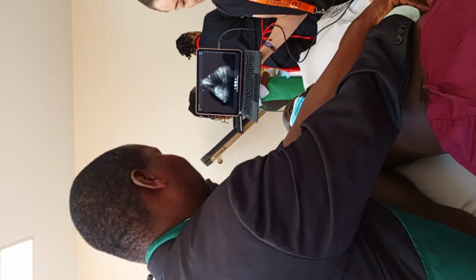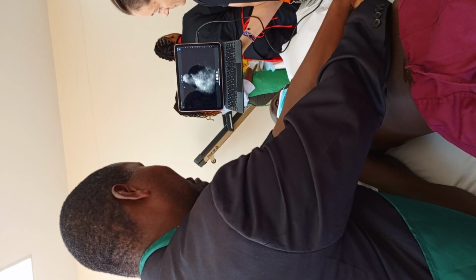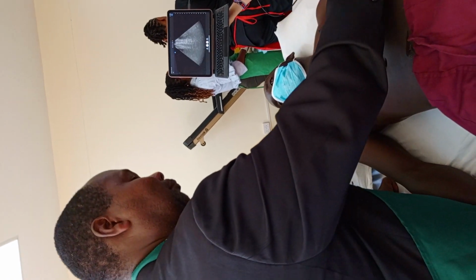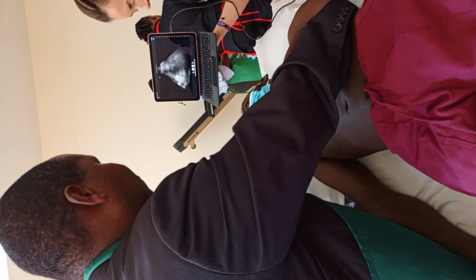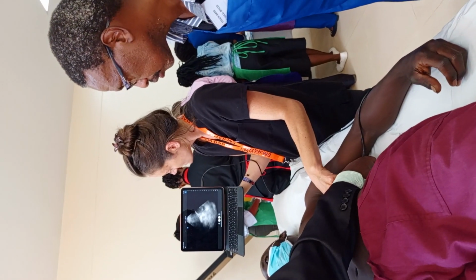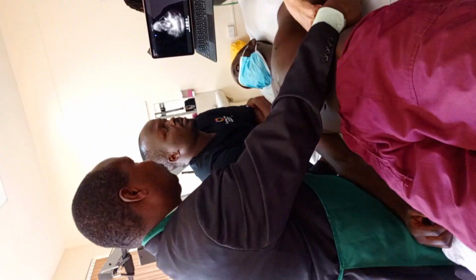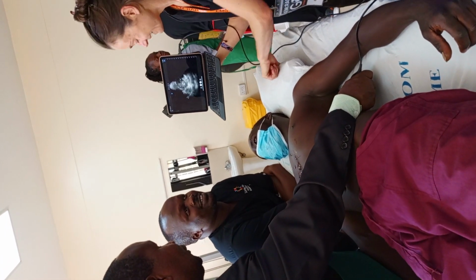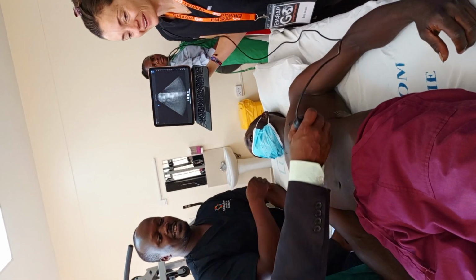We need a lot more gel, guys. We need more gel. A little bit more towards his head. There we go. We're starting to get, what's this? It's a kidney. Kidney, what's that? Spleen. Yeah. There we go. And what's that white line? Yeah. Cool. And then we'll take a look at the suprapubic, our last view.